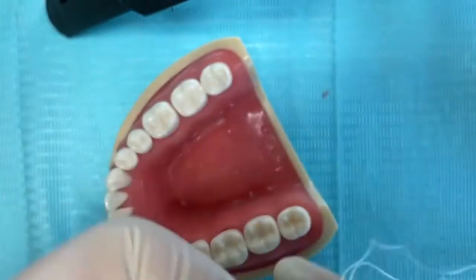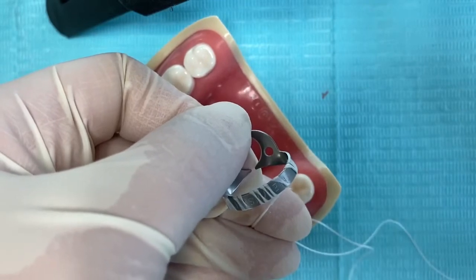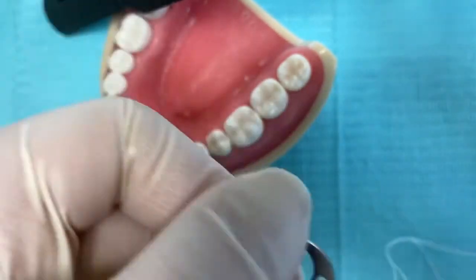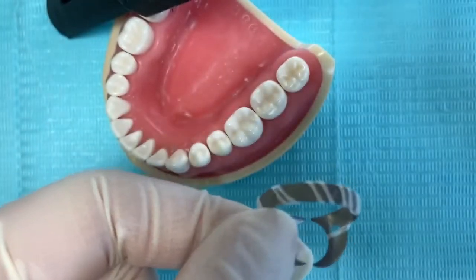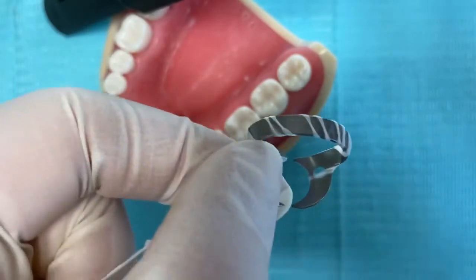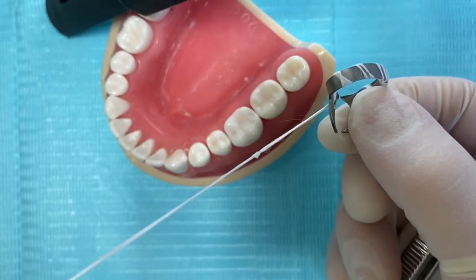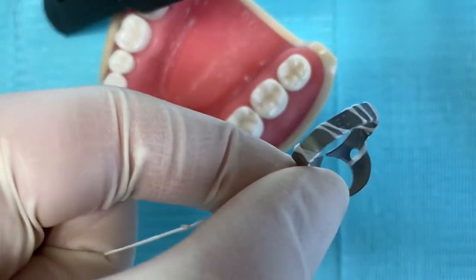Now that we're done rotating around the bow, this is enough — it has secured both sides. Even if the clamp breaks in half, the bow will be secured on both sides with the dental floss and we can always pull it easily. We go ahead and insert the dental floss in the other hole on the other side of the jaw, ligate it again, and make another knot. We'll leave this end outside the patient's mouth so we can retrieve the clamp if any accident happens.